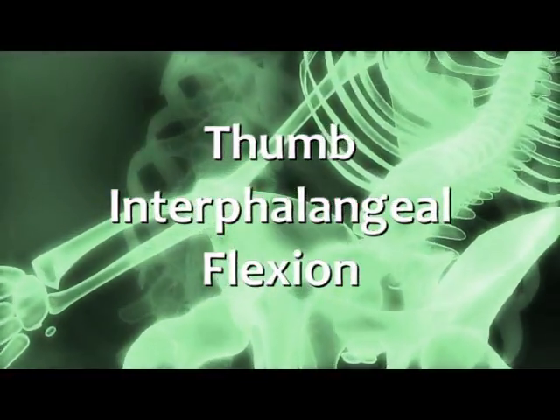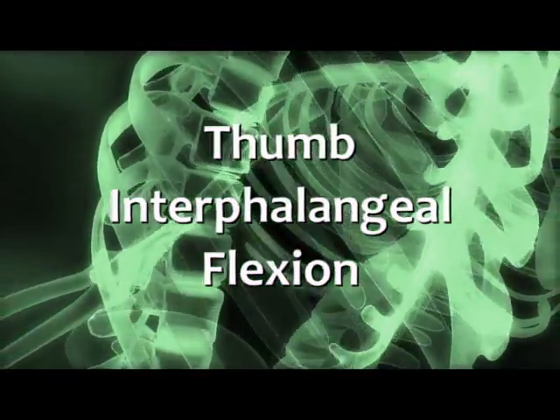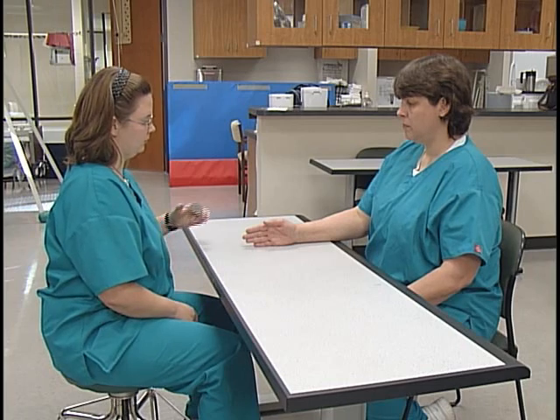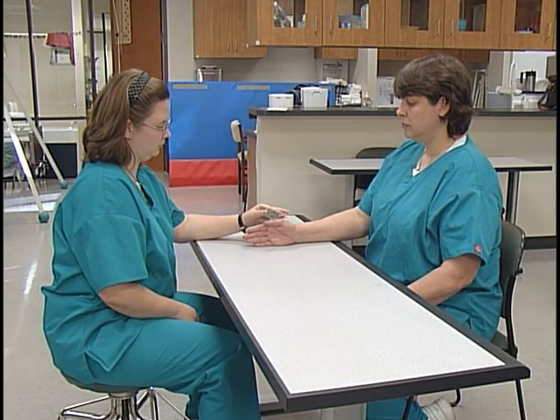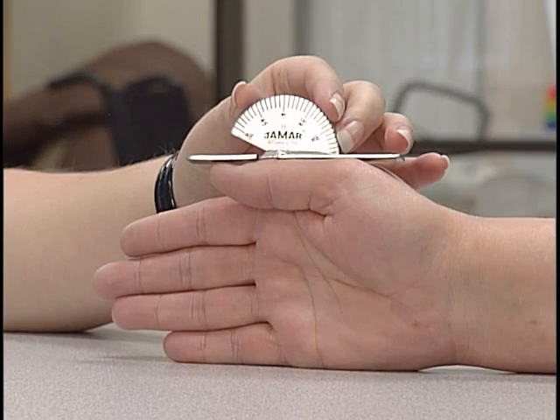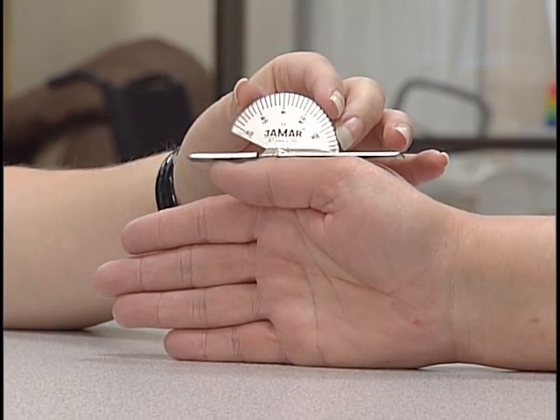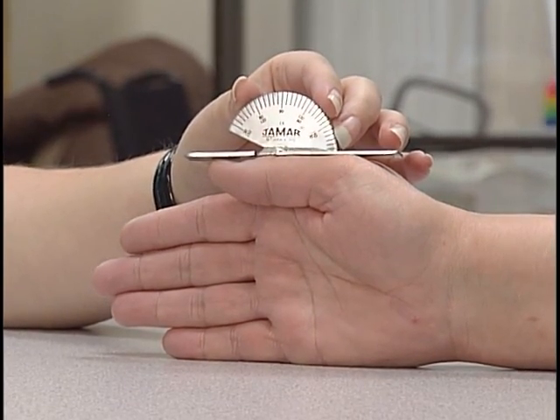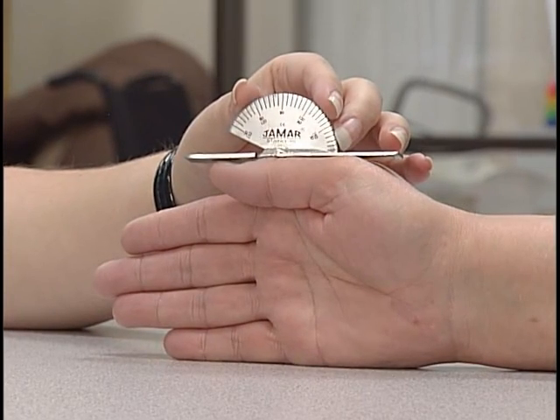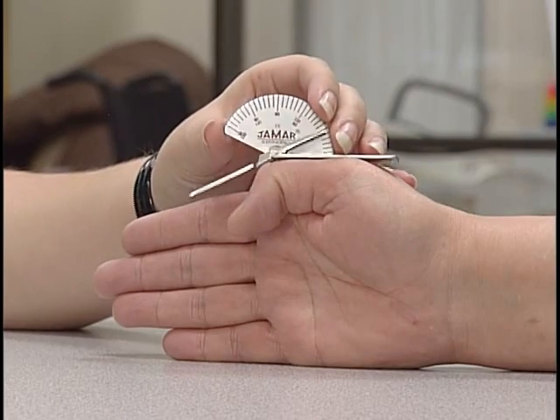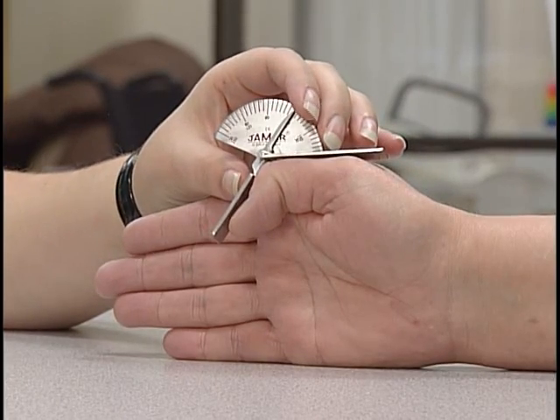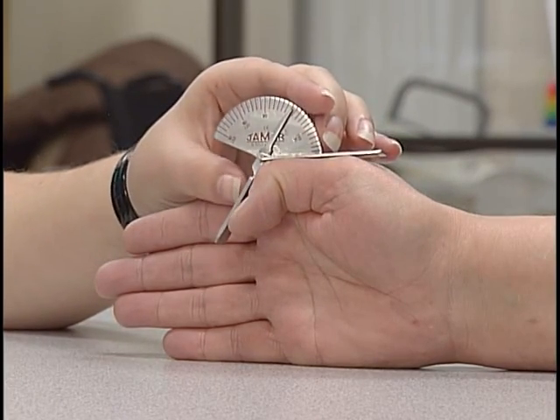For thumb interphalangeal flexion, the position of the subject is the same as for MP flexion. The position of the goniometer axis is on the dorsal surface of the IP joint. The stationary bar is over the proximal phalanx and the movable bar is over the distal phalanx. The client's thumb distal of the IP joint is flexed down. The measurement begins at zero degrees and ranges to 80 to 90 degrees.